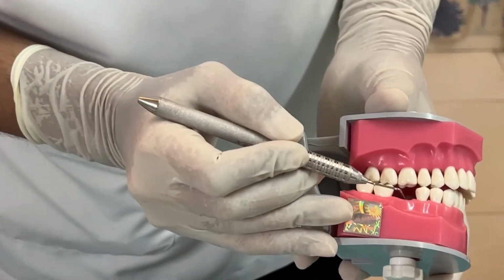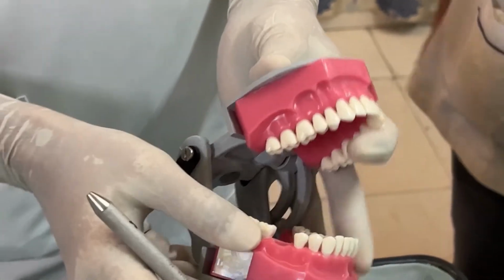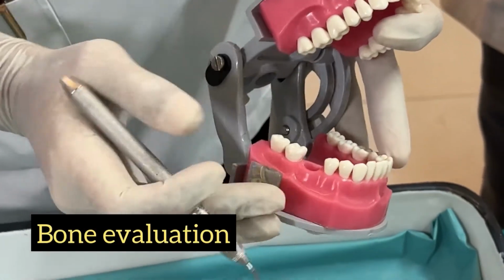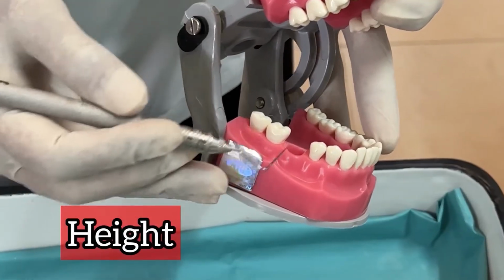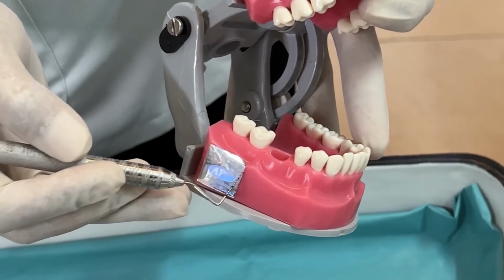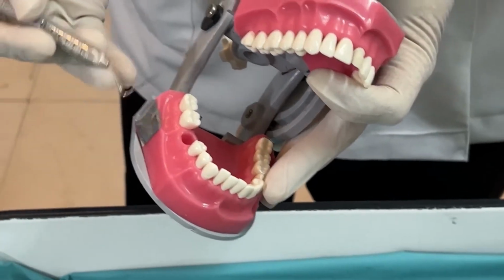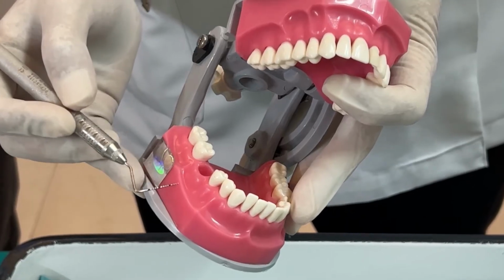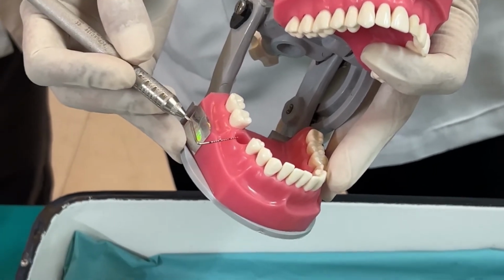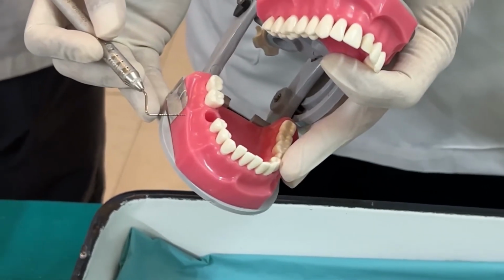Now once you have gathered that ample space is available for tooth placement, the next thing is of course evaluating bone. So how do you evaluate bone? The first thing is you see whether ample height is present from the next vital structure. In this case it would be the mandibular canal. So you advise an OPG, you take an RVG, and you get a rough estimate that ample distance exists from the crest of the bone inside this soft tissue till the mandibular canal.